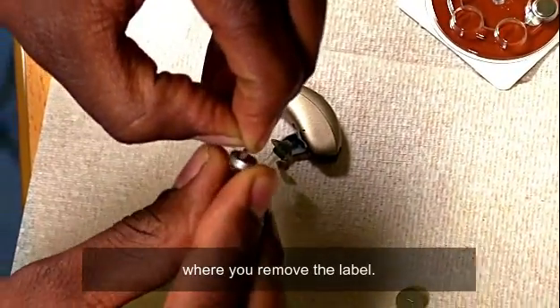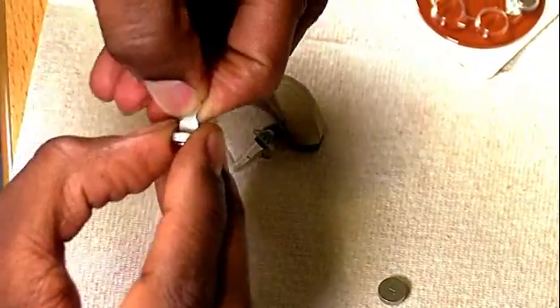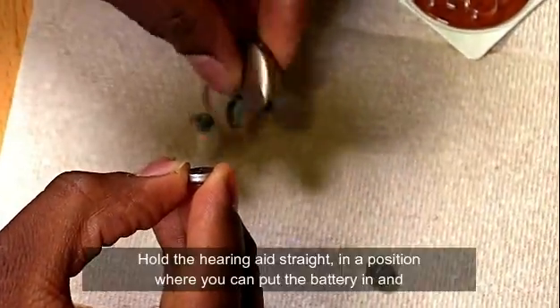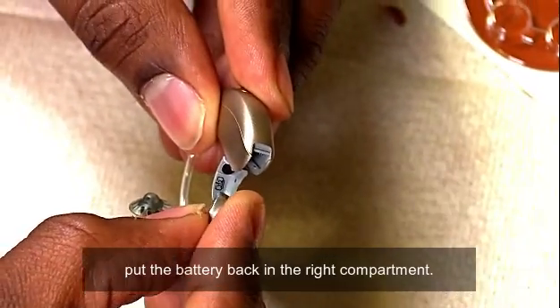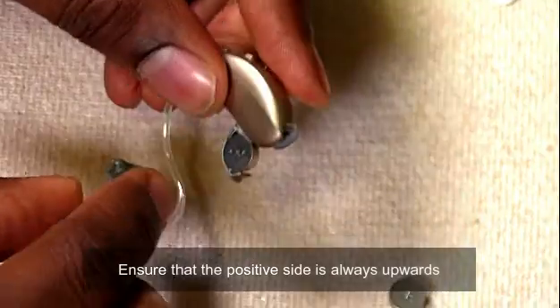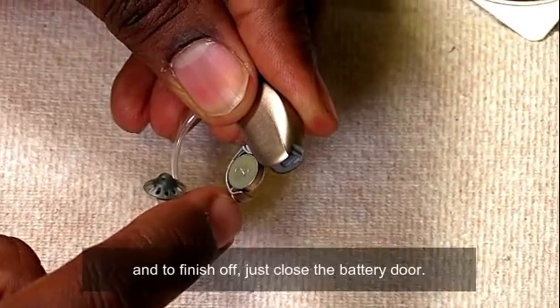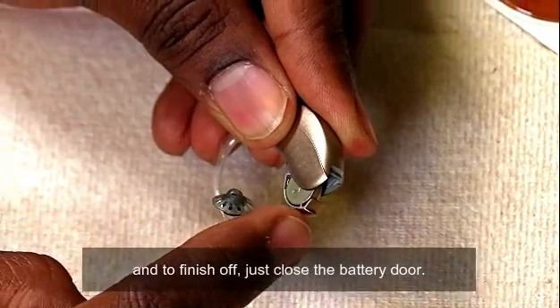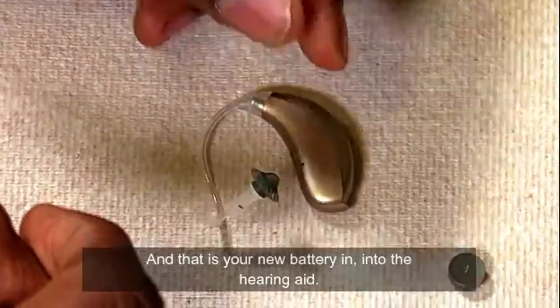Hold the hearing aid straight in a position where you can put the battery in, and put the battery back in the correct compartment. Ensure that the positive side is always upwards, and to finish off just close the battery door — and that is your new battery in the hearing aid.